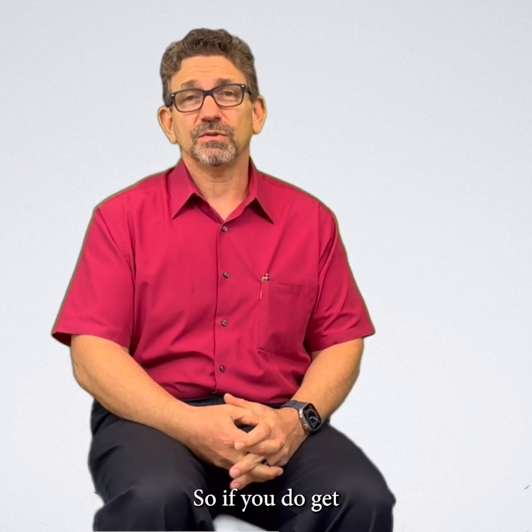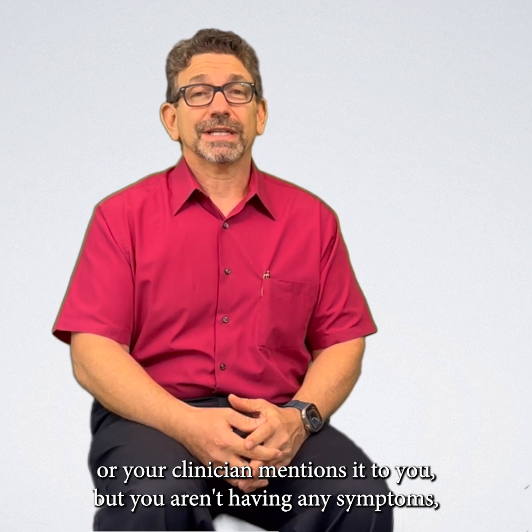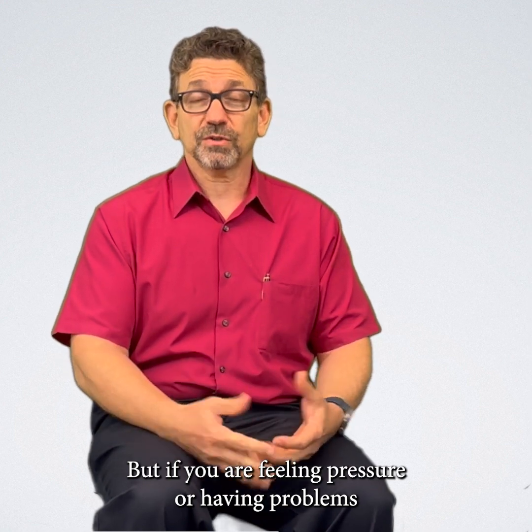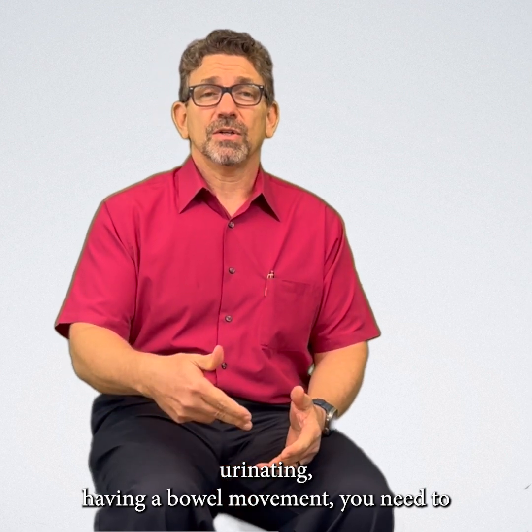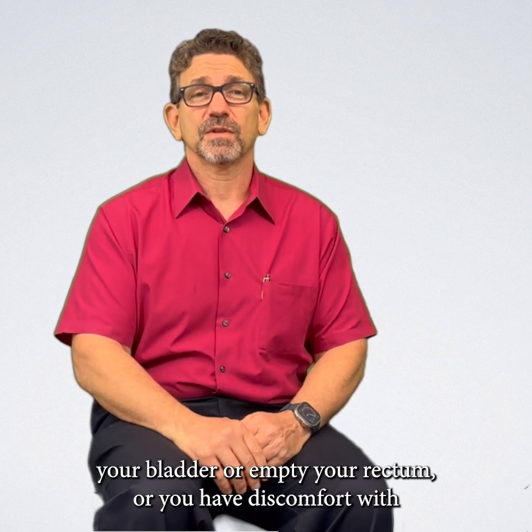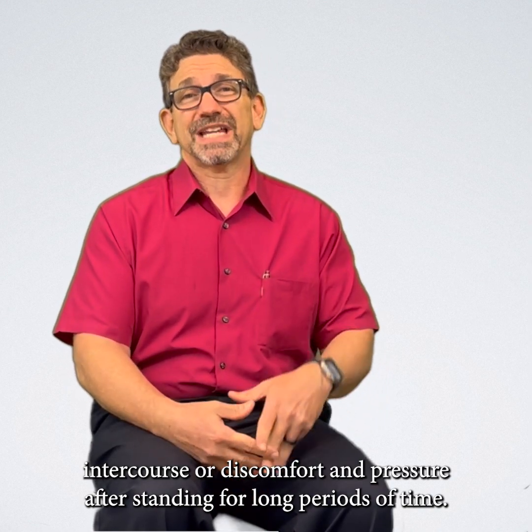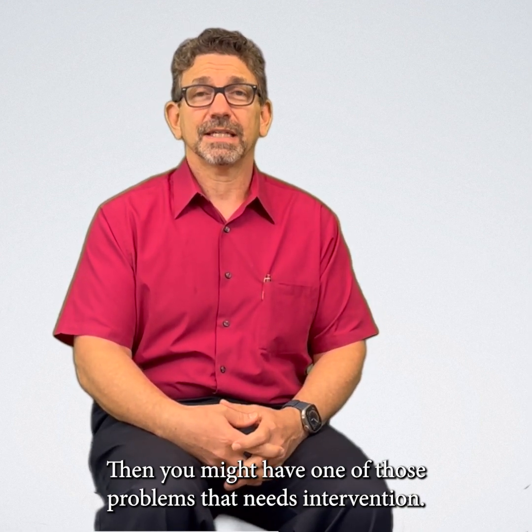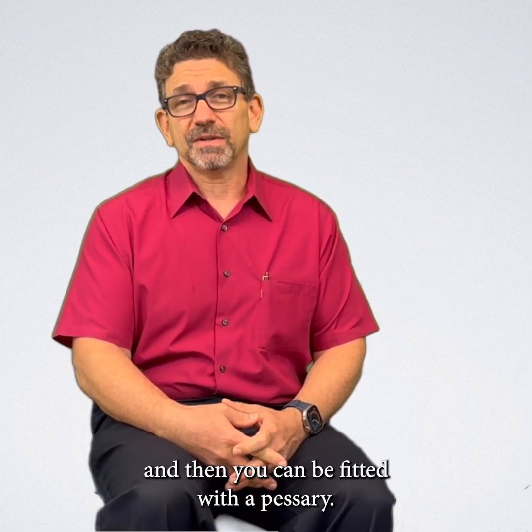If you do have a little bit of a bulge and a physician or your clinician mentions it to you, but you aren't having any symptoms, you don't necessarily need anything. But if you are feeling pressure or having problems urinating, having a bowel movement, you need to use splinting, use your fingers vaginally to help empty your bladder or empty your rectum, or you have discomfort with intercourse or discomfort and pressure after standing for long periods of times, then you might have one of those problems that needs intervention. That can be evaluated by your physician, and then you can be fitted with a pessary.